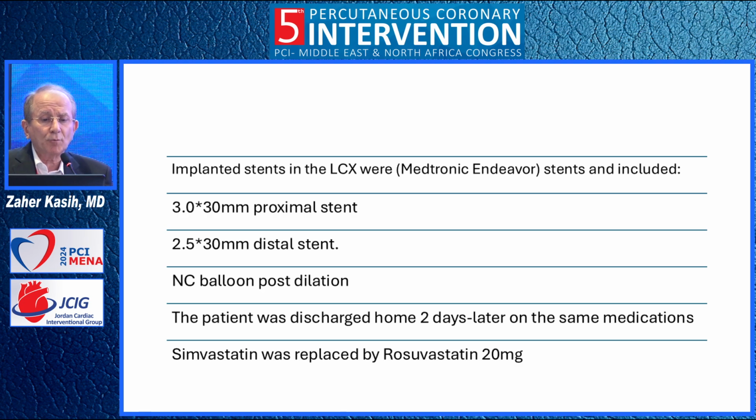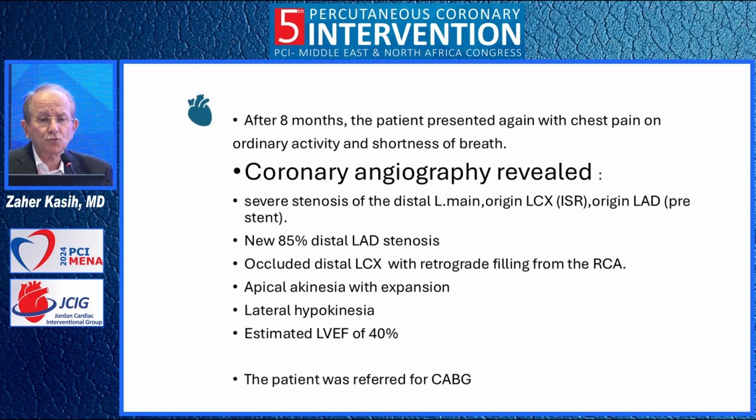And then I used a non-compliant balloon post-dilation. The patient was discharged home 2 days later on the same medications, and simvastatin was replaced by rosuvastatin 20 milligram. 8 months later, the patient presented again with chest pain on ordinary activity and shortness of breath.